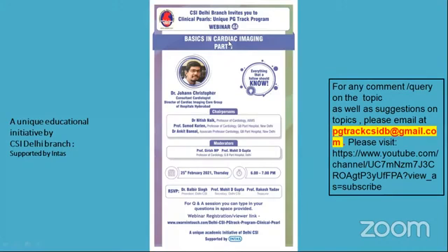So that's where, post devices, we look at the PET scan. We do a baseline MR in these patients, especially in the inflammatory cardiomyopathies. We do a baseline MR, we do a baseline PET, we put in the device, and then the follow-up every year is generally done by PET alone.